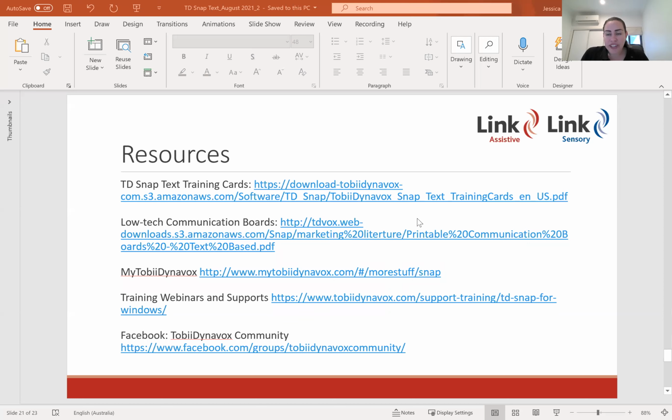Finally, we'll finish up by providing you with a few helpful resources. The TD Snap text training cards are an excellent resource. They're created to be very user-friendly for caregivers and for clients.